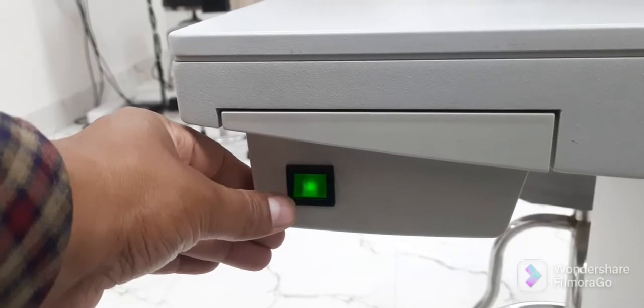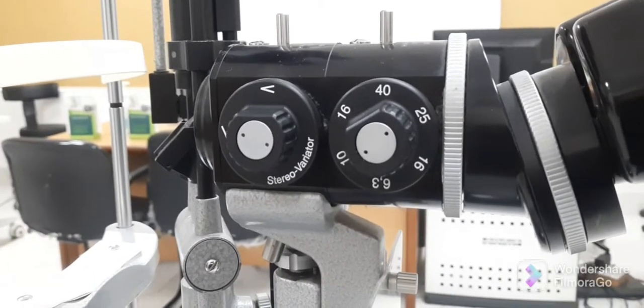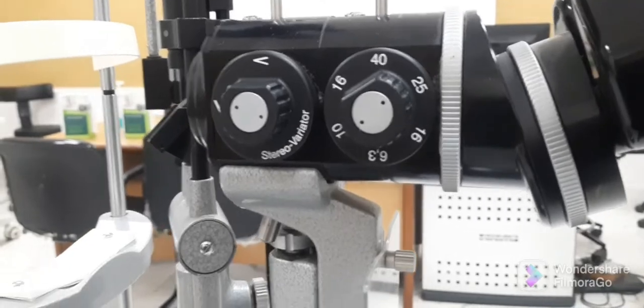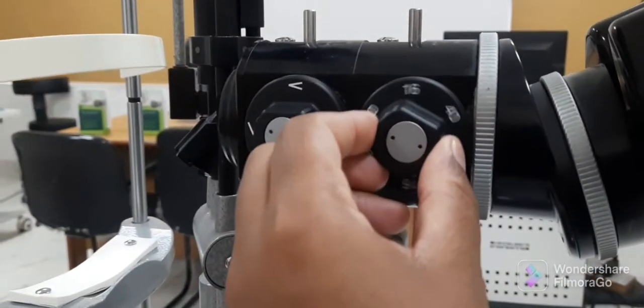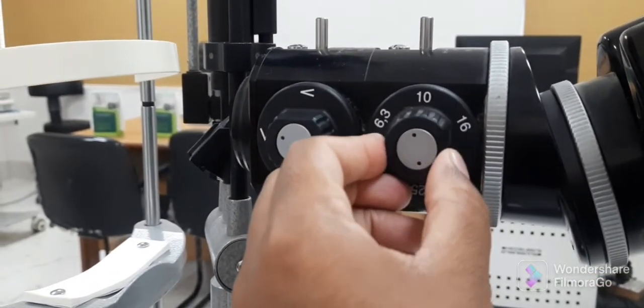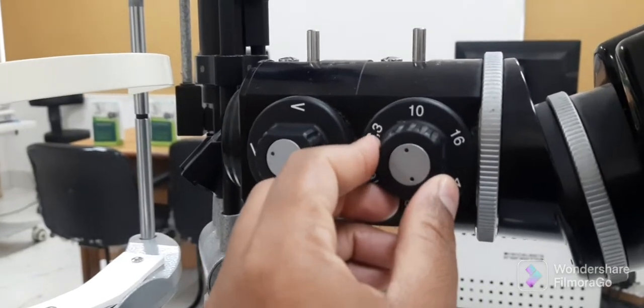Adjust the magnification by rotating the magnification dial on the slit lamp to 10x, or you can use 16x also. The magnification should not be too low or too high.